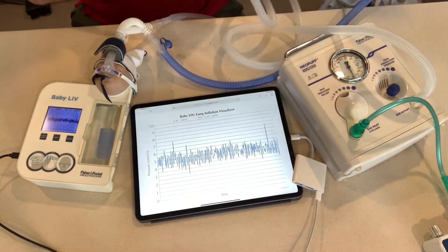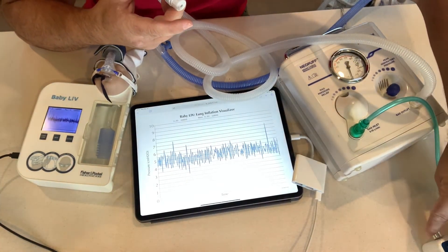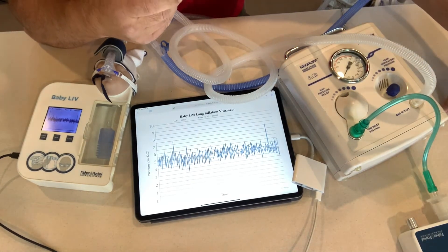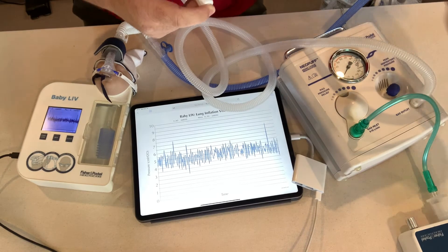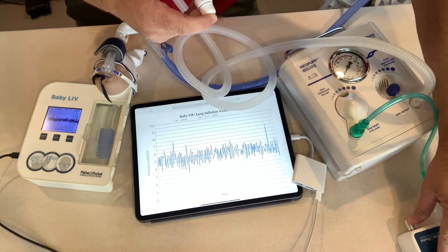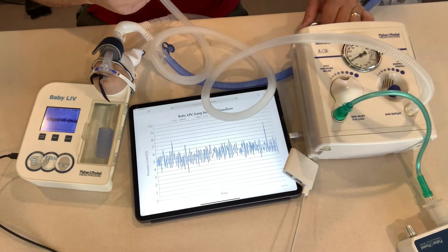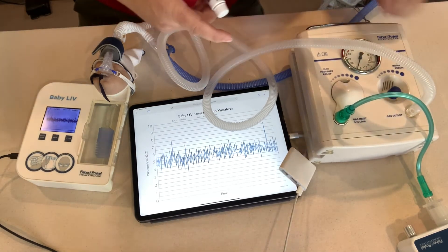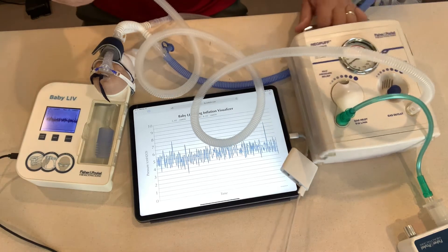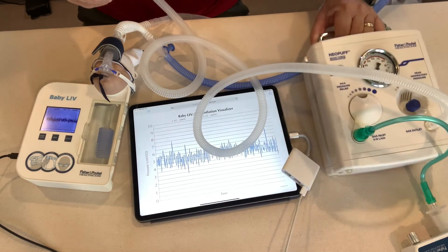I'm going to set my pressure. I want a PIP of 20 and a PEEP of 5. I'll set my flow — these blowers are a little tricky, you have to mess with them a bit to get it just right. I have a PIP of 20 now, and when I release I have a PEEP. I'll adjust my PEEP cap to five.